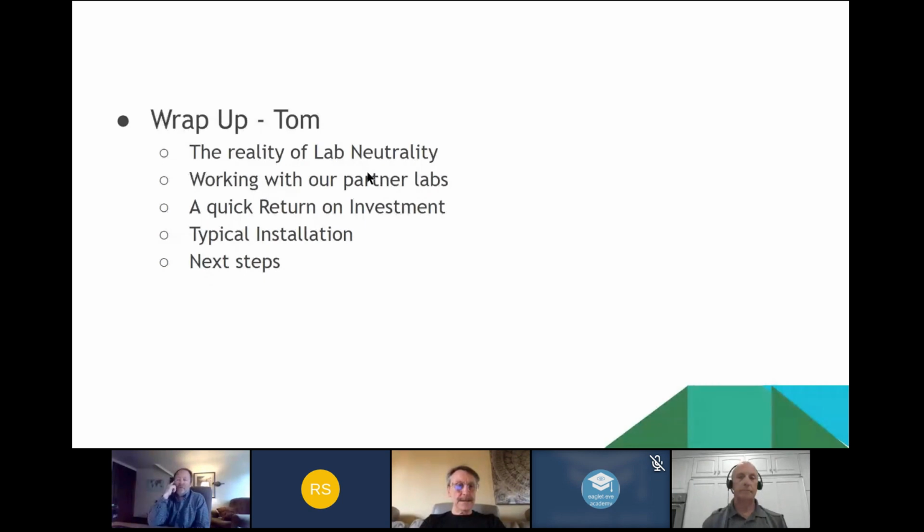We're pushing an hour now, so I'm going to try to really move. I'm going to do the wrap up, and what I'm going to focus on is I'll run you through the reality of lab neutrality, and I'll talk to you about how we work with our lab partners. Then I'll run you through a quick example of a return on investment. Then Arnie will step up and talk about the typical installation, and then I'll quickly wind up with next steps at the end.